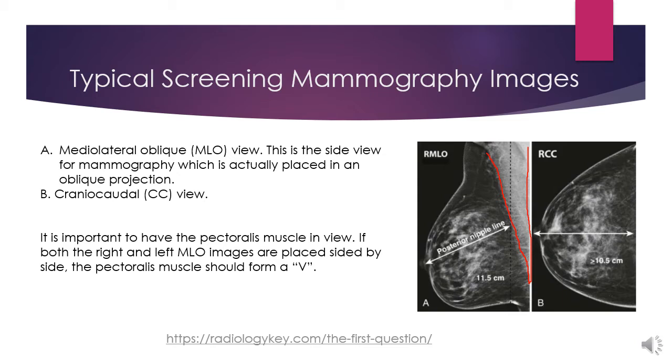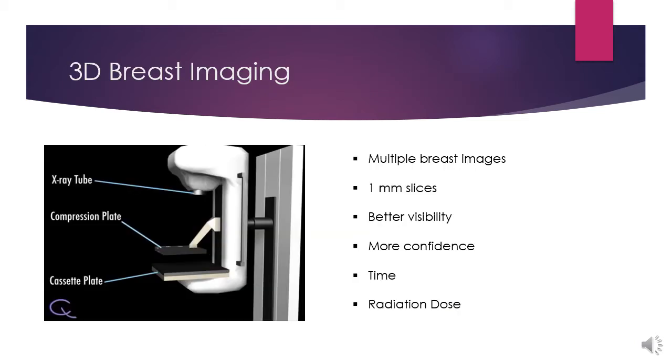The image on the right is the right CC view. Again, we want to look and see about getting as much muscle back here as we can. It is difficult on some patients to get that muscle, but it's something that a mammography technologist strives for.